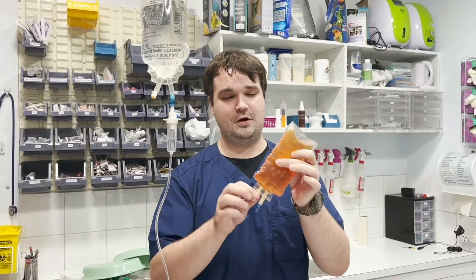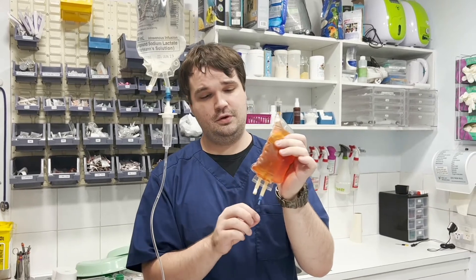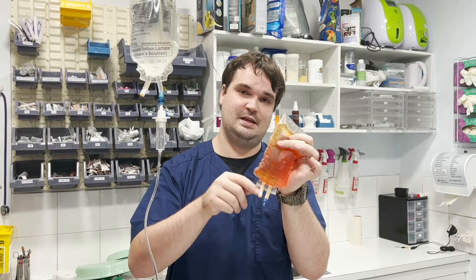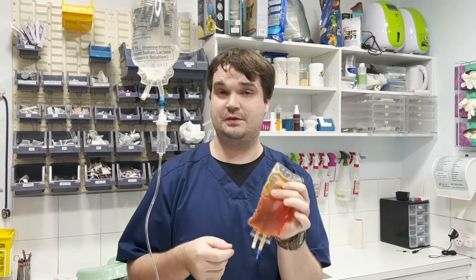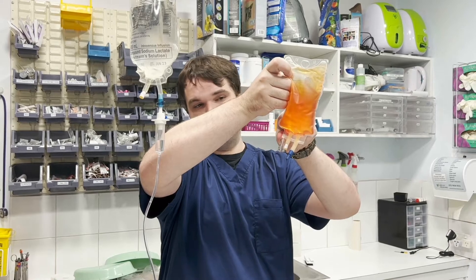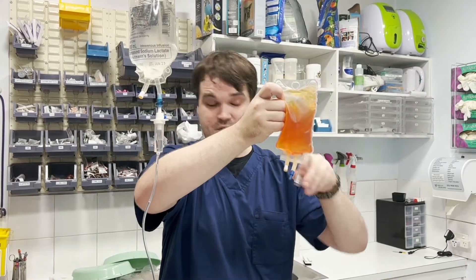Something I didn't include in the previous video about making up the Marek's vaccination was that when pump-injecting into these bags, the medication can just sit in the little hub down here — especially if it's a small vial. And if you haven't got the correct concentration in the bag, then you most likely won't get the desired outcome, be it a vaccination or a constant rate infusion that has opioids in it.